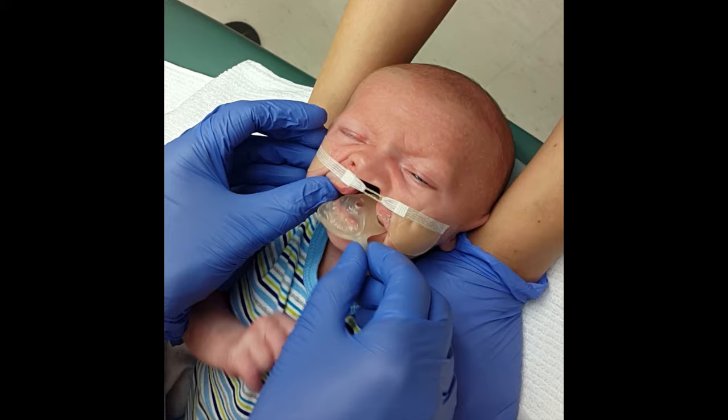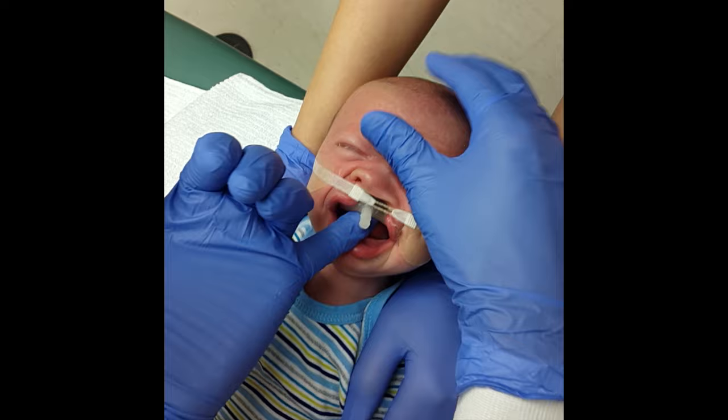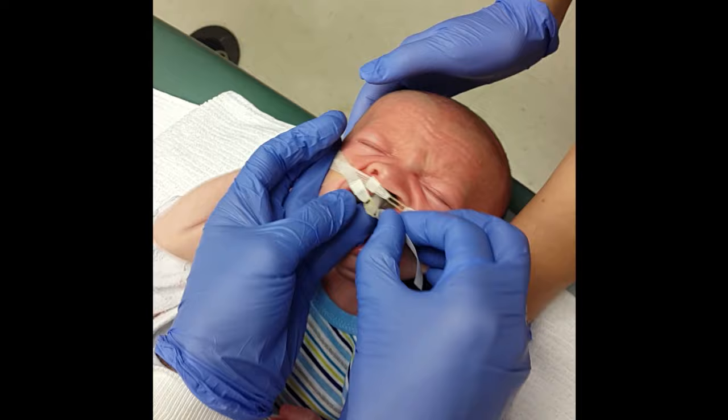The molding plate is inserted at a 90-degree angle and rotated into the mouth. Using one finger to stabilize the plate, two additional retention tapes are then used to secure the device in place.